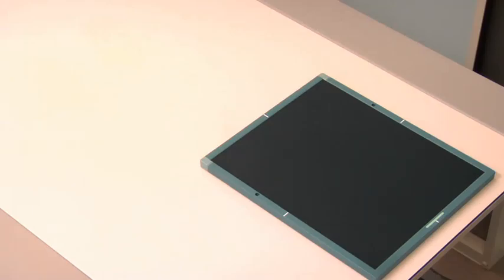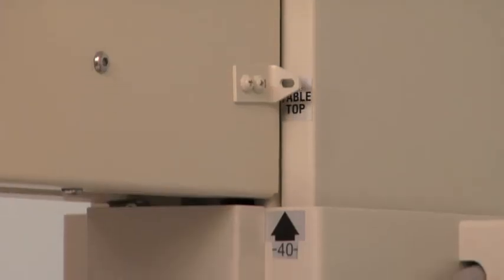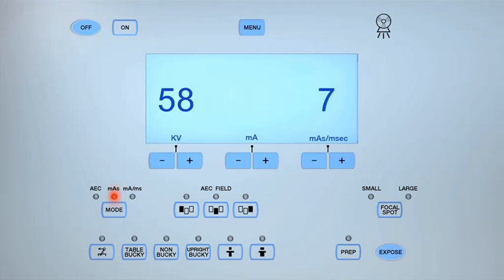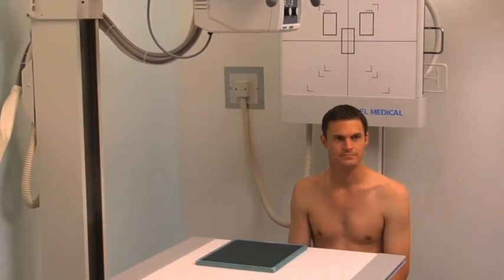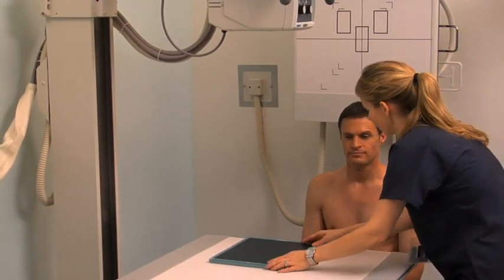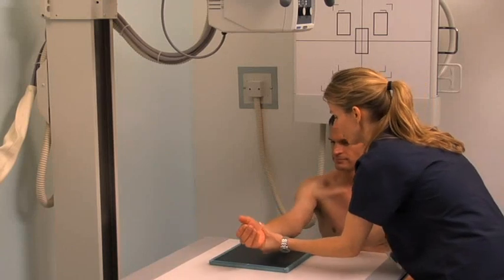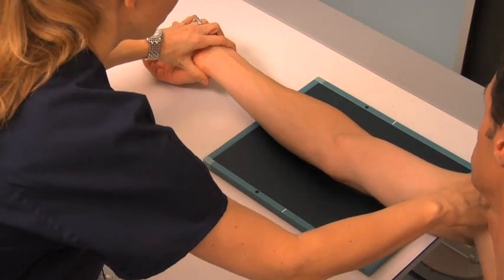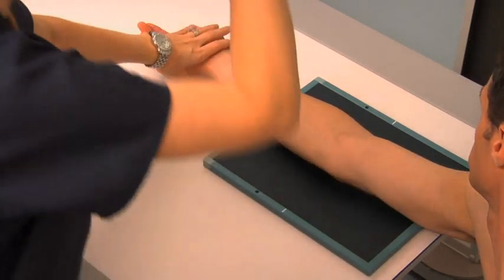To obtain a radiograph of the elbow in the AP projection, select a 10-by-12-inch cassette and place it on the tabletop. Set the SID to 40 inches and align the central ray perpendicular to the cassette. Select the non-bucky setting and the small focal spot. Set the exposure parameters to between 55 and 60 kV and 4 and 6 MAS. Ask the patient to sit at the end of the table and protect their reproductive organs with a lead shield. Ask the patient to extend their arm fully, resting the posterior aspect of their arm and forearm on the cassette with their elbow in the center; the patient may have to roll laterally to bring the hand and forearm into supination.